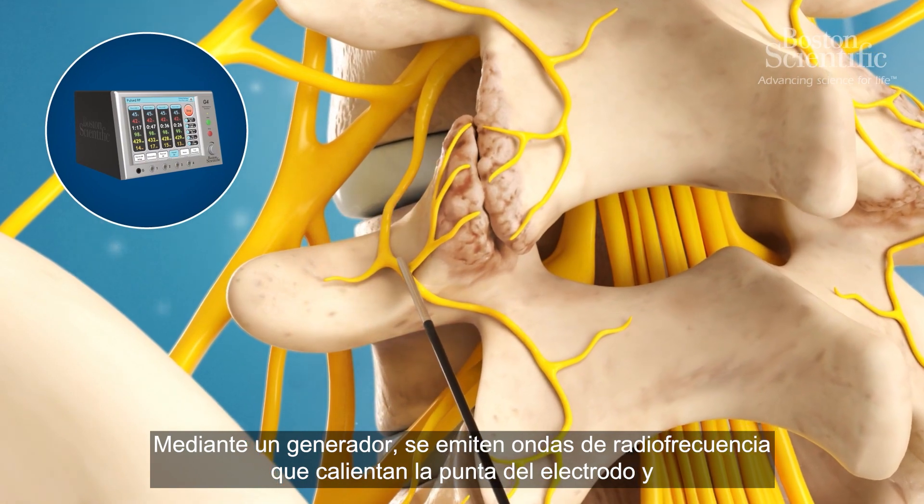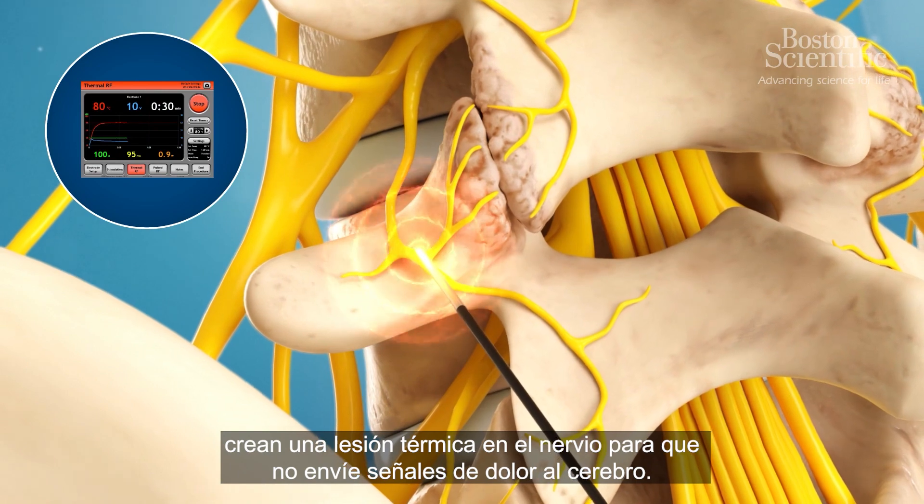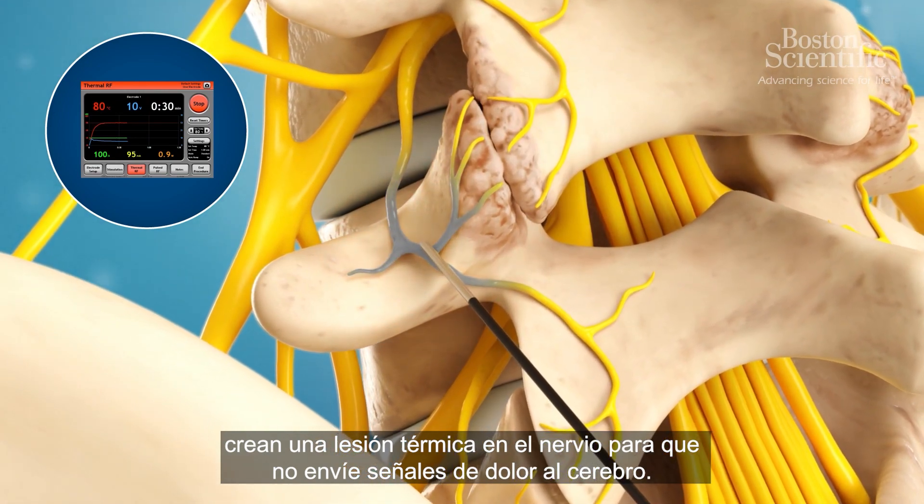Using a generator, radiofrequency waves heat the tip of the electrode and create a heat lesion on the nerve, stopping it from sending pain signals to the brain.